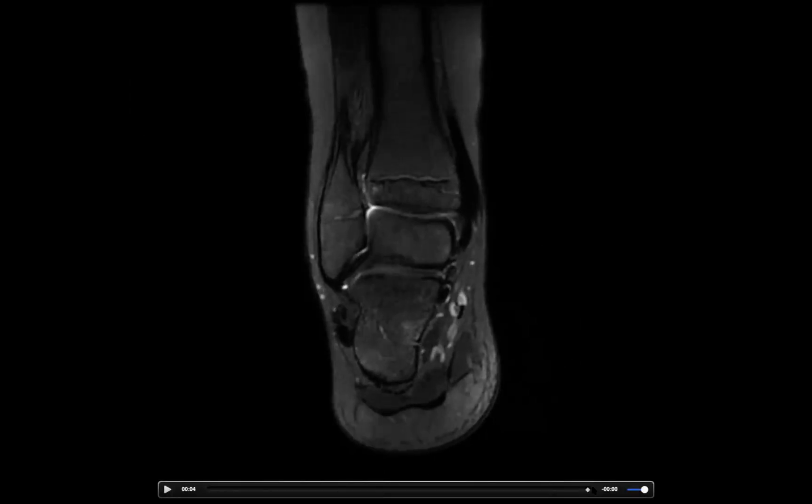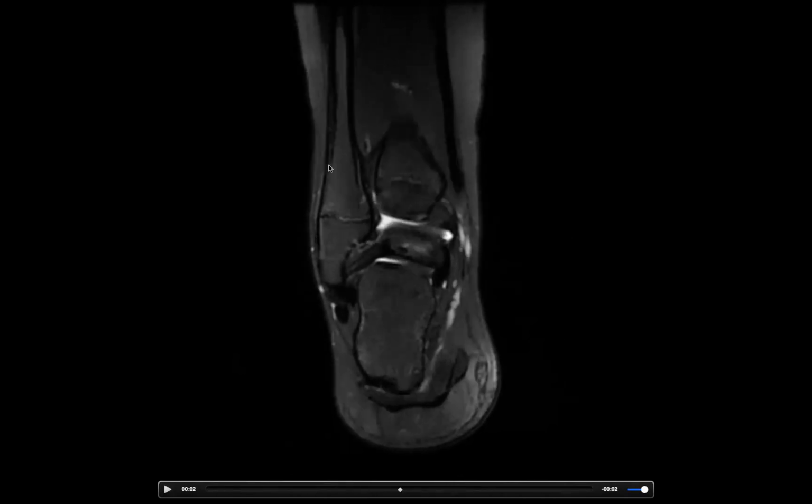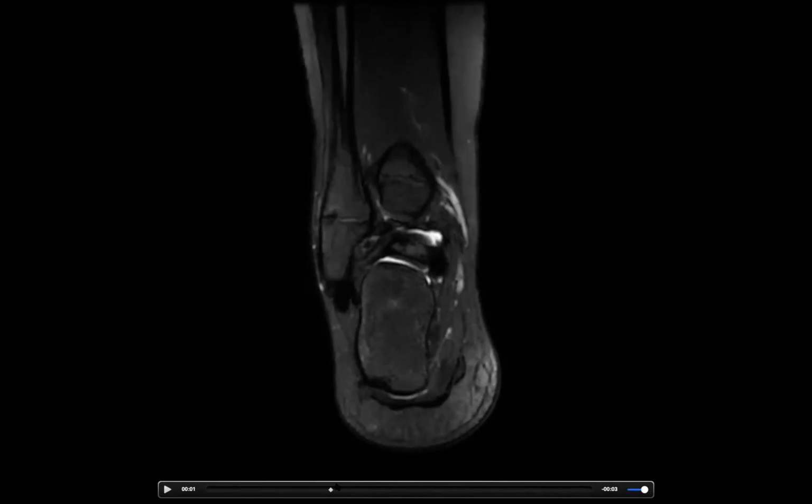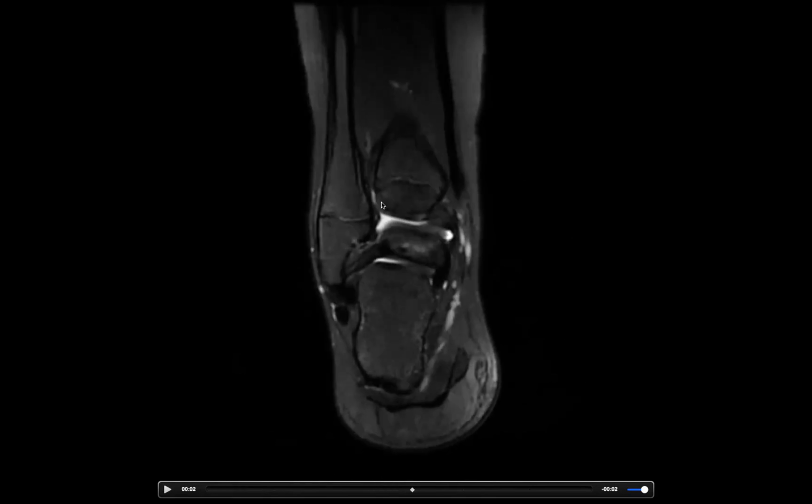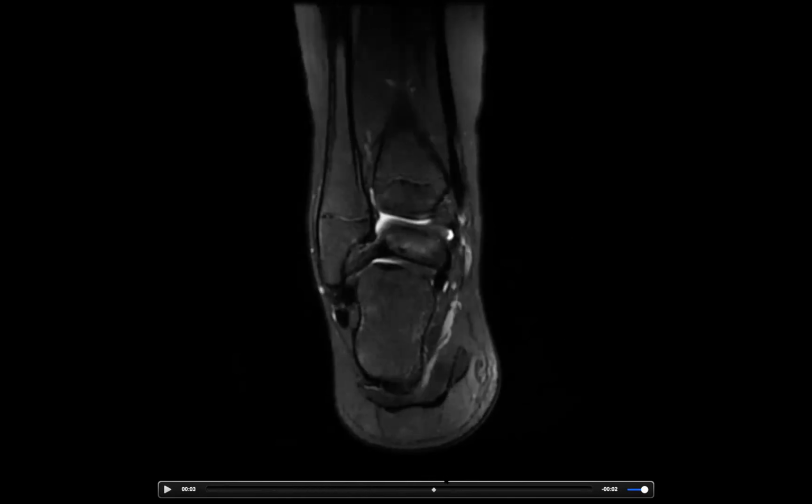Let me just go past this one. I think this one is sort of harder to appreciate the issue, but maybe I'll just go through it a little bit here. So again, this is that T2 shuffle sequence. And so this is the fibula bone. And I think Mickey is quite familiar with this anatomy these days. So kids, again, they have these growth plates, and you can see the cartilage is quite bright here. And in this particular case, the growth plate is lost right here. And there's a bone bar there, or bony bridge, right?